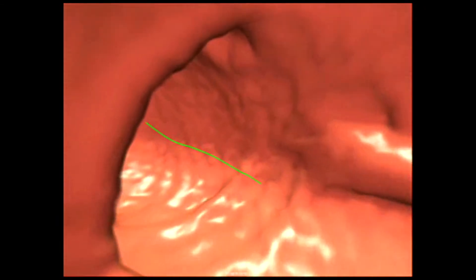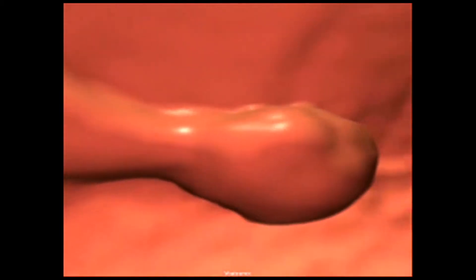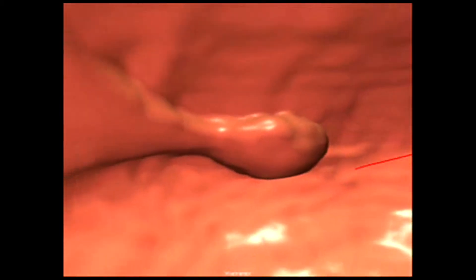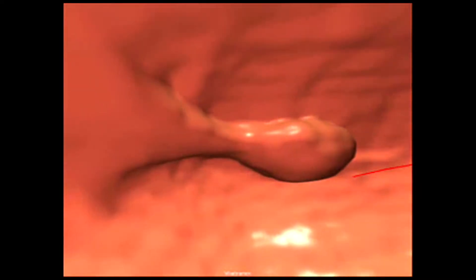The holes in the wall are diverticula. We're passing another large polyp. We're going to turn around and turn on what's called a transparency or translucency view, which is a color map based on density. This is used to primarily distinguish soft tissue from tagged stool. If you have a higher density lesion, like tagged stool, it'll show up as white, with a soft tissue polyp appearing as a red core.